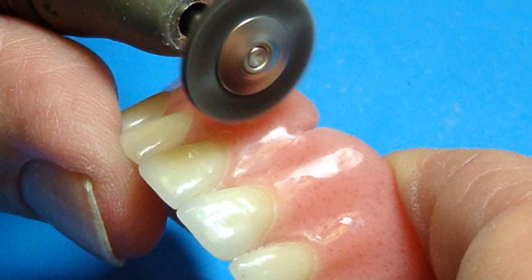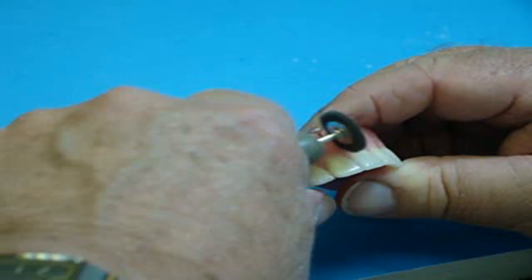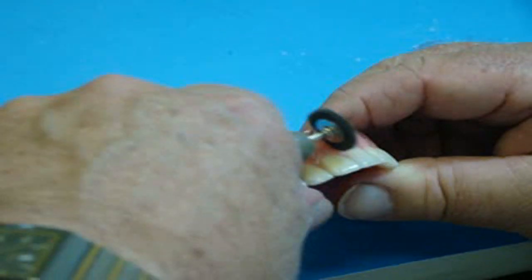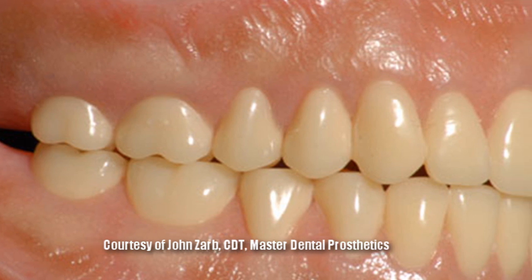Remember all that labial anatomy that is rather difficult to preserve when polishing with large brushes or wheels? Now you can easily work with a small brush or a soft wheel in and around your special anatomy.